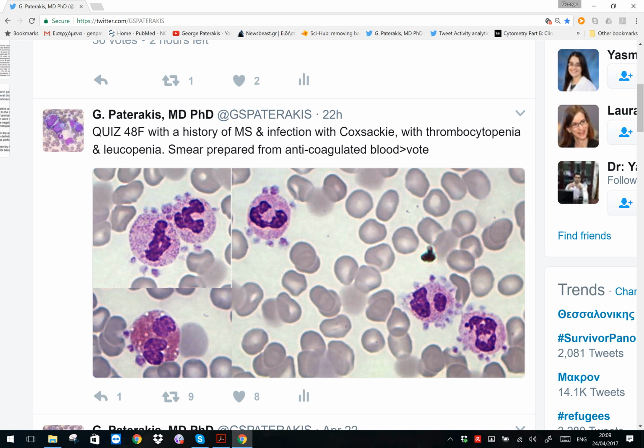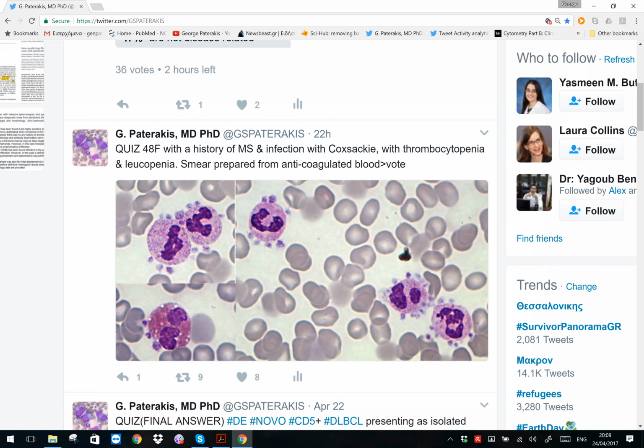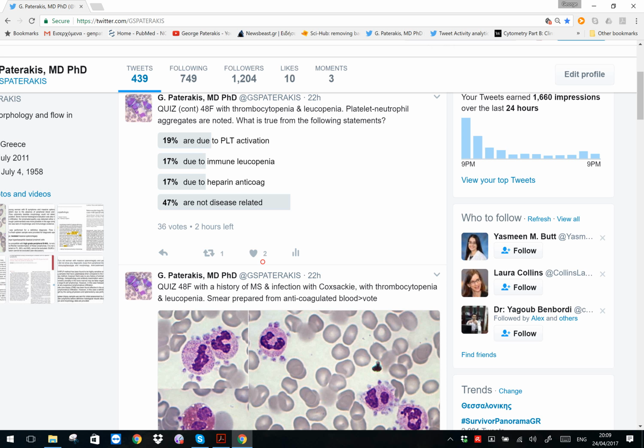But is this true? Here we can see a smear prepared from anticoagulated blood, and there is evident adherence of platelets to neutrophils and some eosinophils here. So what was our quiz? Our quiz was these options.